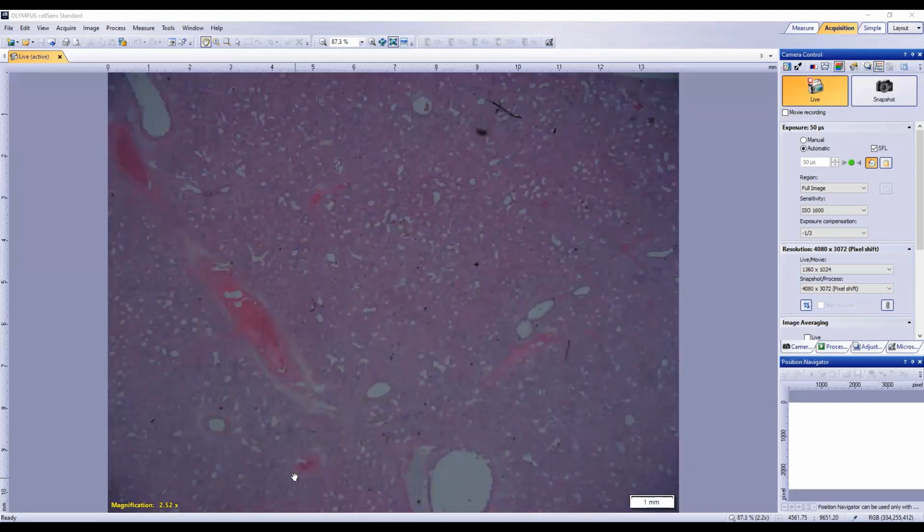Then lymphocytes and macrophages, and the macrophages might be hypertrophic. Probably not going to describe them as epithelioid specifically for a Rhodococcus abscess. And then a fibrous capsule. So Sahar, throw us some descriptors for what the fibrous capsule is going to look like.